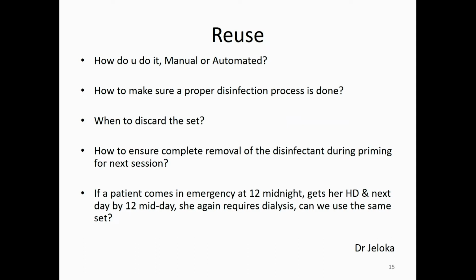More than 2000 milligram per liter. Whatever commercial brand you are using, before priming, you put a few drops on the strip. If it turns dark brown or black, then the disinfectant was present, so you are sure that disinfection was properly done.